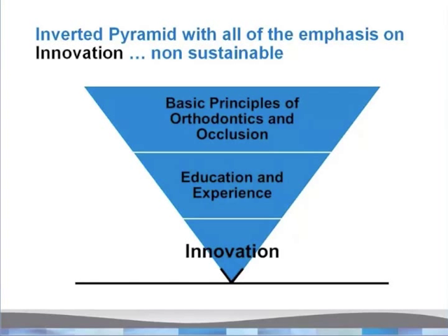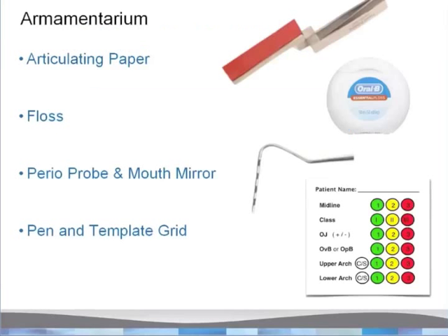Dr. Hodge? Thank you, Dr. Brandt. And really, that speaks to the nature of what we have planned into the templates. And what's going to be amazing to our listeners is to find out just exactly how simple this is. And so the innovation is one of simplicity and predictability that is based upon the fact that there is a reproducibility of certain treatment approaches. So that brings us to the point of the armamentarium that we'll be using in working with these templates.